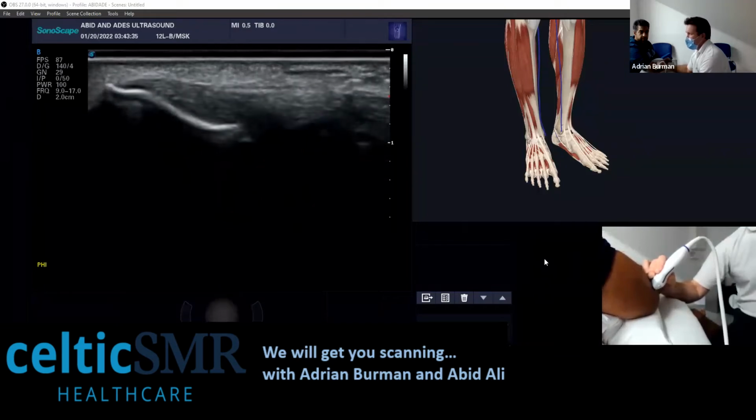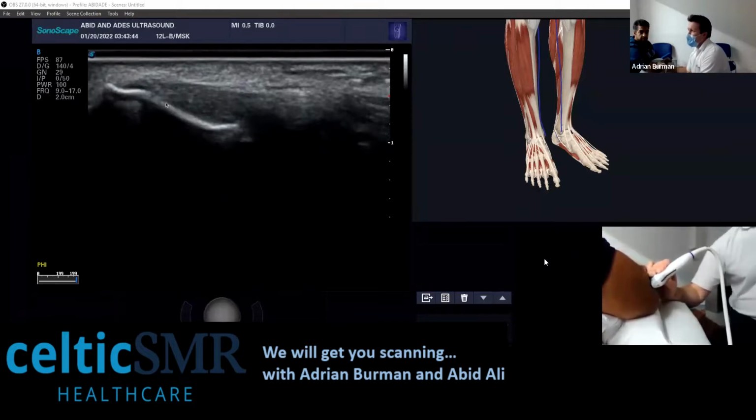Okay, then put the Doppler on. And what you tend to have is a little anechoic defect here. You might get a little bit of cortical irregularity. It might be a bit of avulsion injury with the bone sort of slipping up here.